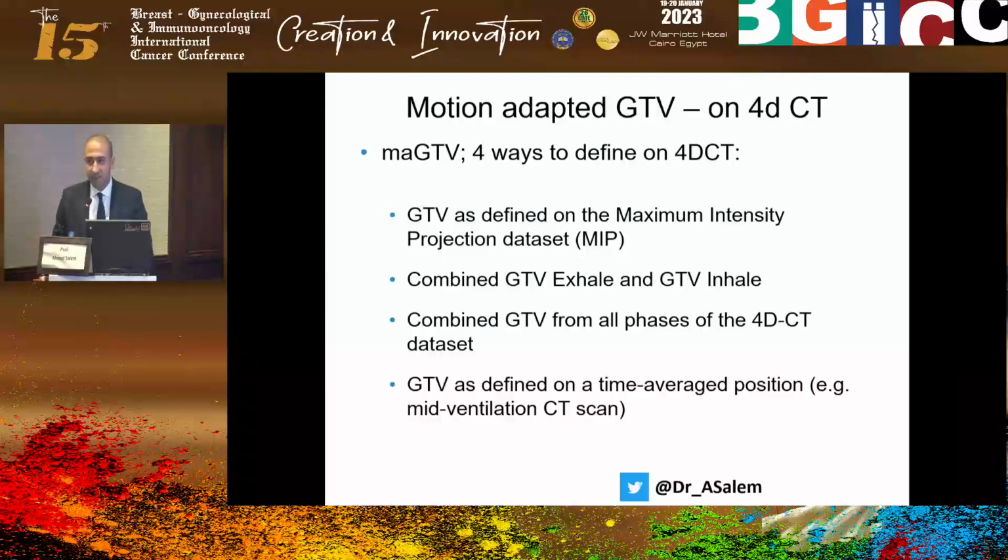Calculate the free-breathing baseline. First the patient in deep inspiration, then free breathing, and calculate the range of respiratory movement and contour on the average. Okay, so you do an untagged, just free breathing CT scan, and then you do a deep inspiration scan. Yes, and see the range. Okay, and you fuse them together, and then you get an average position. Yes. So pretty much you do this time averaged position in a very clever, resource-friendly way, without the need for having the equipment for the 4D.